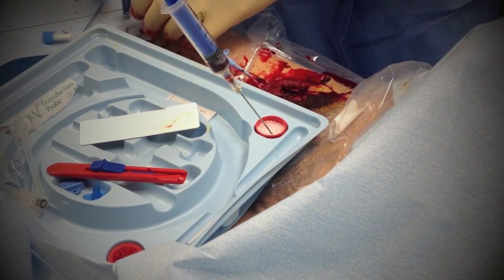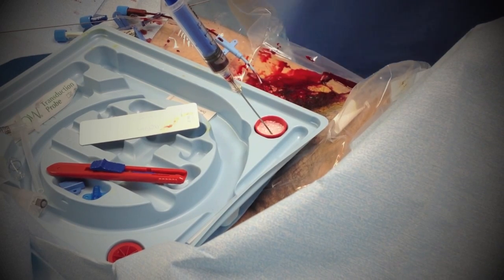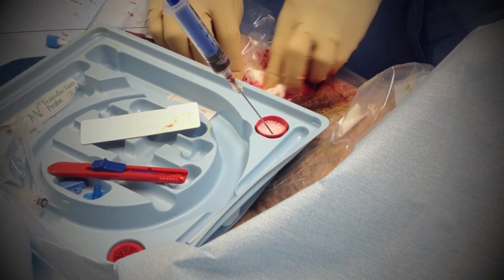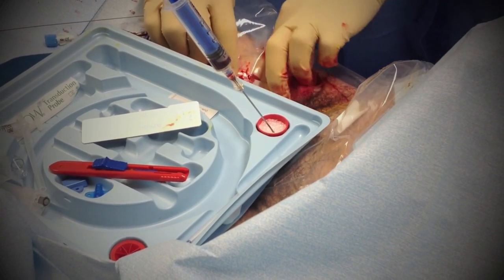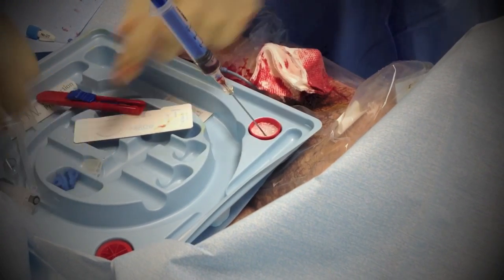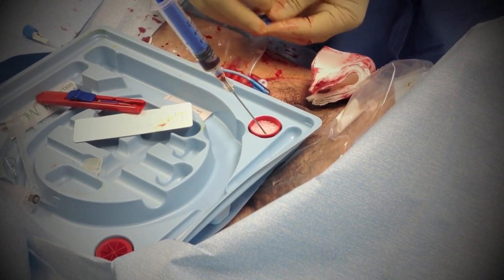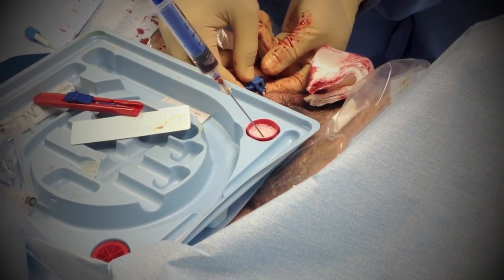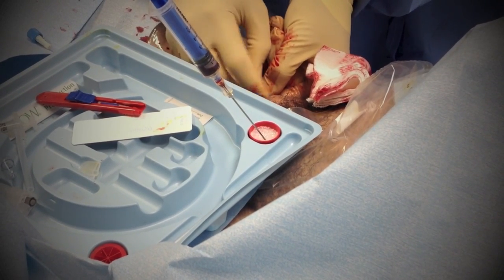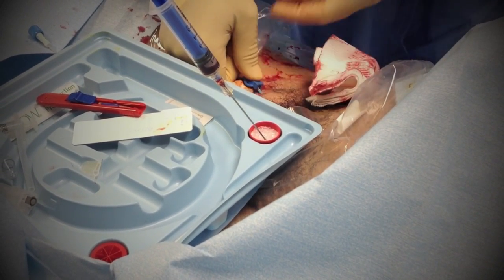You got excellent flow of blood here in the first port. Normally it doesn't bleed this much, but it's no problem — we've stopped it. It stopped once I put the big line in, because once you dilate the vein, all you have is the guide wire. There's a big hole in it, so it just bled through.